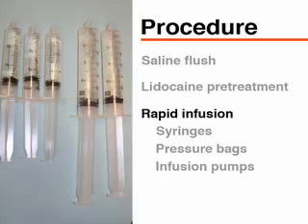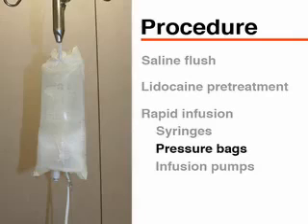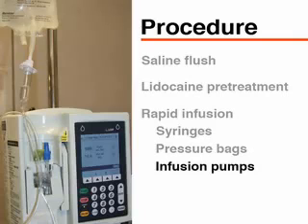When a rapid infusion rate is crucial, a bolus infused manually with syringes is the most efficient way to quickly deliver a considerable volume of fluid. Pressure bags and infusion pumps may also be used.